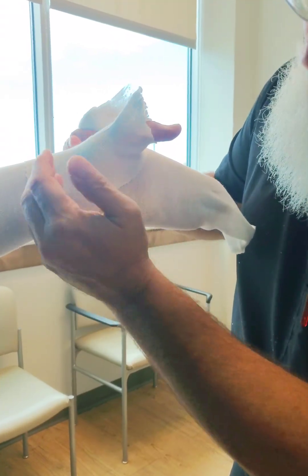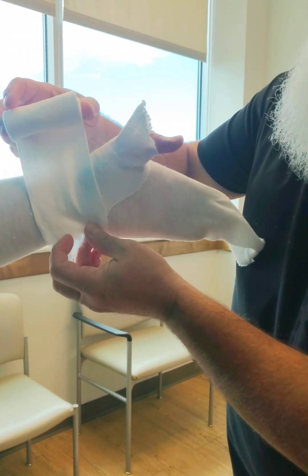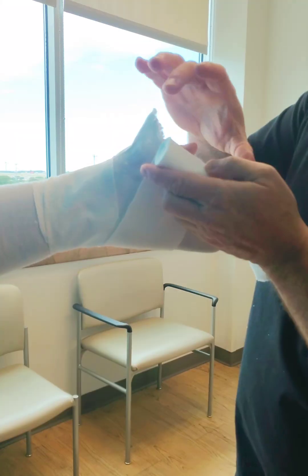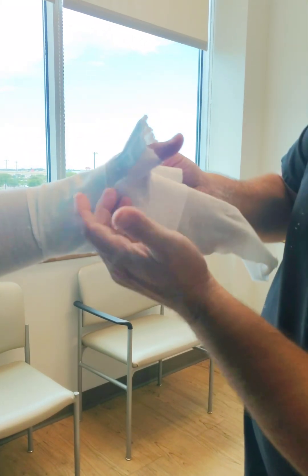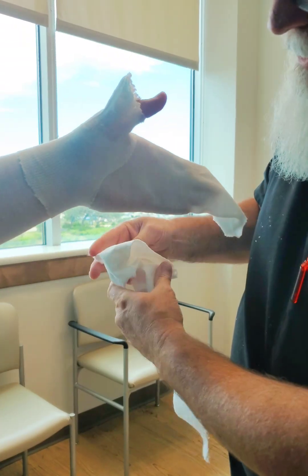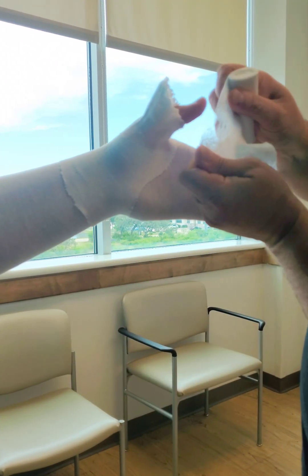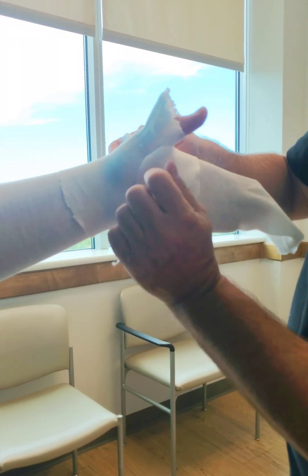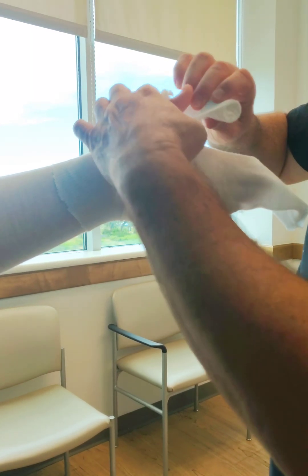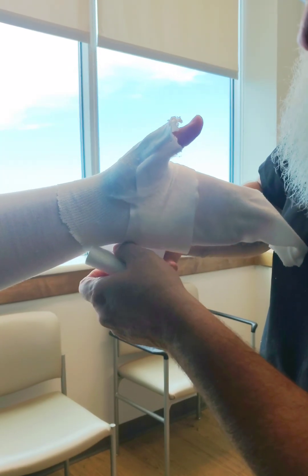Now when you're doing the cotton — recheck yourself here. A lot of us that have been doing this for ages know that back in the origins of all this, we would start at the wrist, create our anchor, and work our way up through the palm. But in this particular cast, because you want to get a good ulnar deviated mold, an option would be to start at the palm, get rid of all your wrinkles, go through there once or twice. This way, when you go to get that mold the doctor ordered, you're not going to have an overabundance of cotton there.